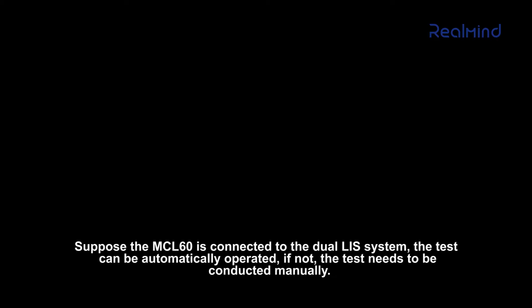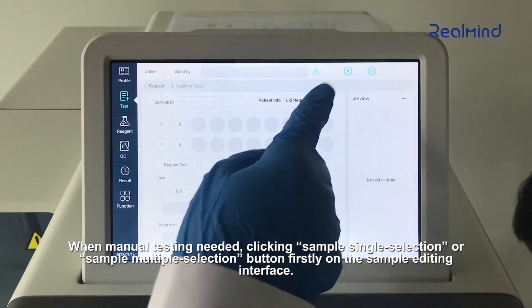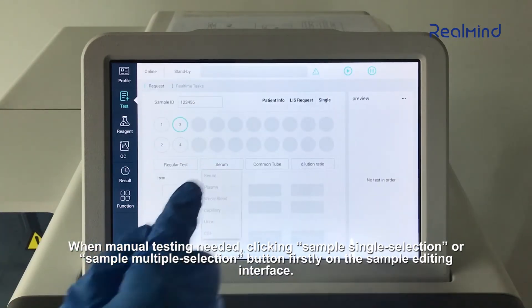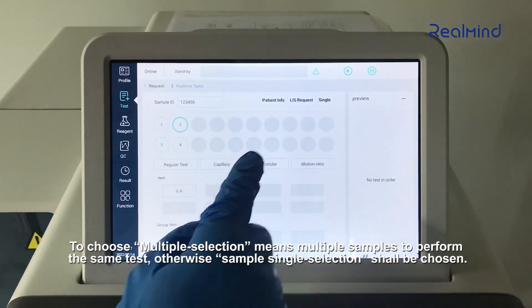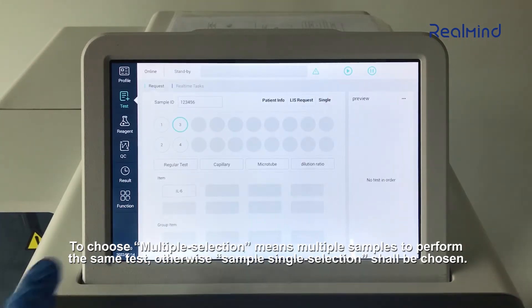If the MCL-60 is connected to the dual LIS system, the test can be automatically operated. If not, the test needs to be conducted manually. When manual testing is needed, click the Sample Single Selection or Sample Multiple Selection button on the sample editing interface. Choosing multiple selection means multiple samples will perform the same test; otherwise, sample single selection should be chosen.